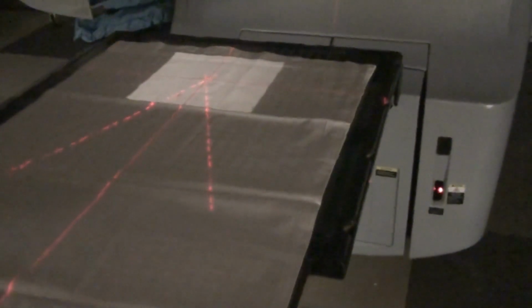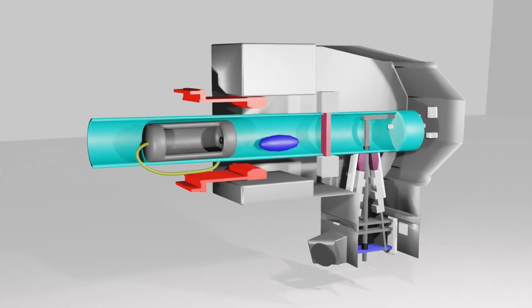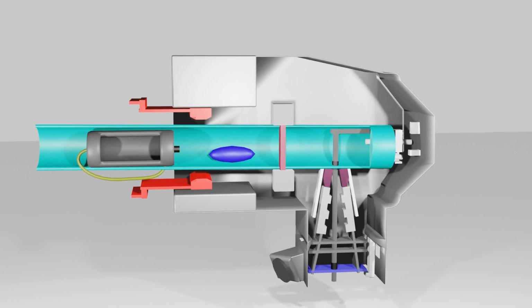The statistical uncertainties of the results range between 1 to 3% for all tally values. The simulation time for each calculation point is approximately 1 to 2 hours on a PC at 1700 MHz.